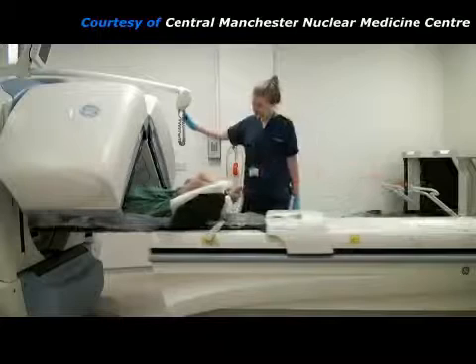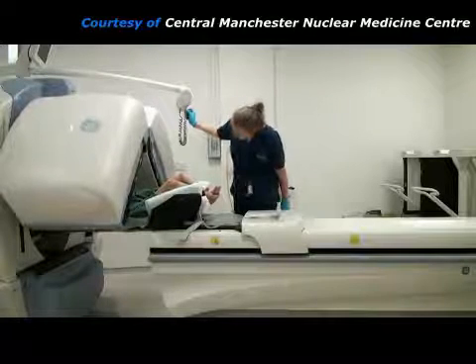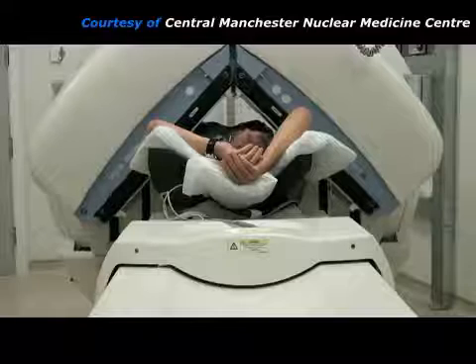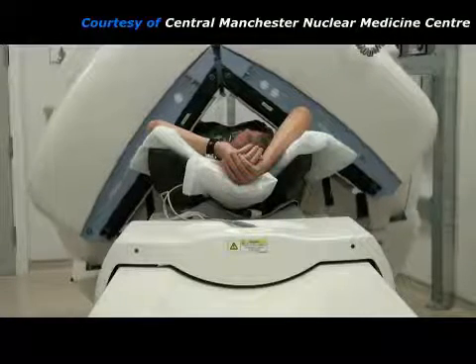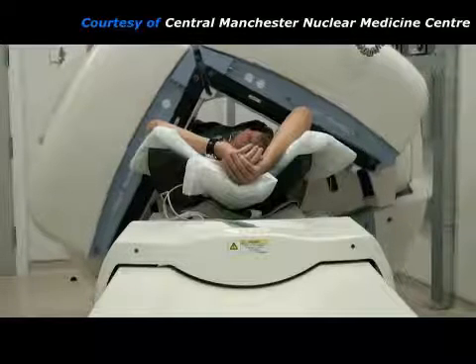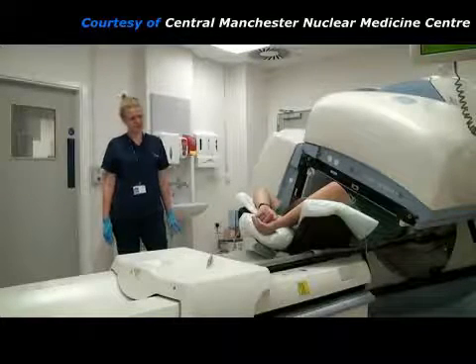The imaging couch moves towards the gamma camera until the patient's heart is positioned in front of the two detectors. The patient's head stays outside the detectors, but they must move close to the patient's chest in order to get good pictures of his heart. The detectors will come close to the patient but there are sensors to prevent them from actually touching. The gamma camera takes a pair of pictures with its two detectors, then moves a bit and takes another pair of pictures. This is known as SPECT, which stands for single photon emission computed tomography. This series of pictures will allow a computer to reconstruct cross-sectional images through the heart showing blood flow to the heart muscle, the myocardium. During this time, the practitioner will be watching from close by even though the patient may not be able to see them.